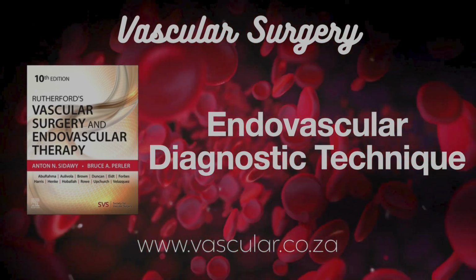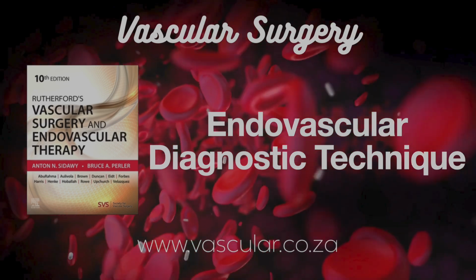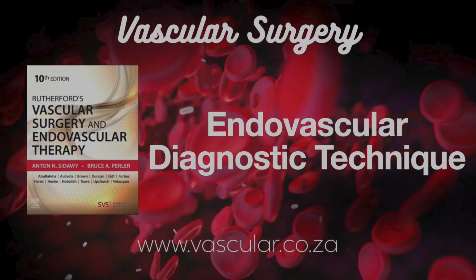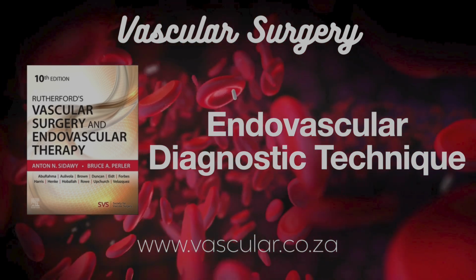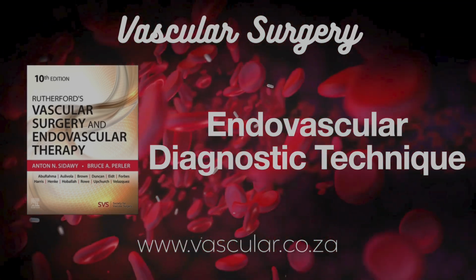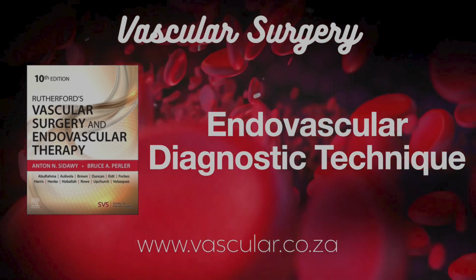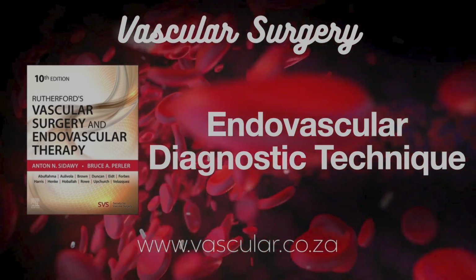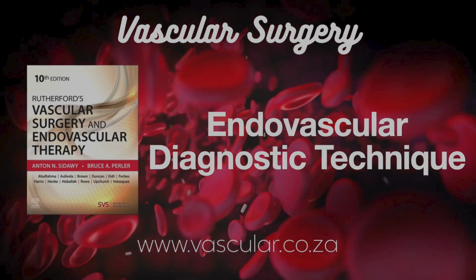What about imaging the leg you started from? Often just injecting through the sheath already in the iliac is enough for the ipsilateral side. Can you use a power injector for selective runs? You can, but you have to reduce the rates and pressures way down. Advantage is the team can stand back from radiation. Disadvantage is you lose that ability to adjust the injection based on what you're seeing live.